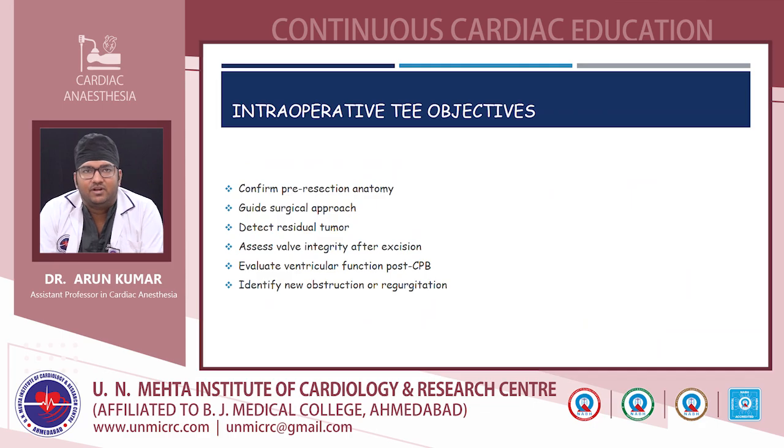So the intraoperative TEE objectives in cardiac tumor excision are to confirm the pre-resection anatomy, to guide the surgical approach, to detect any residual tumor after excision, to assess the valve integrity after excision, to evaluate the ventricular function, to identify any new obstruction or regurgitation if present.